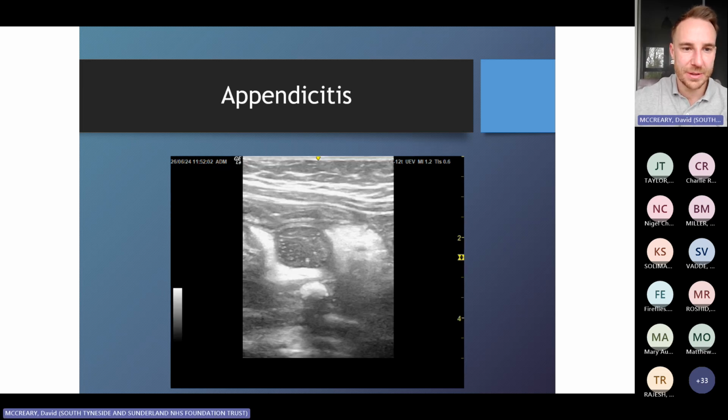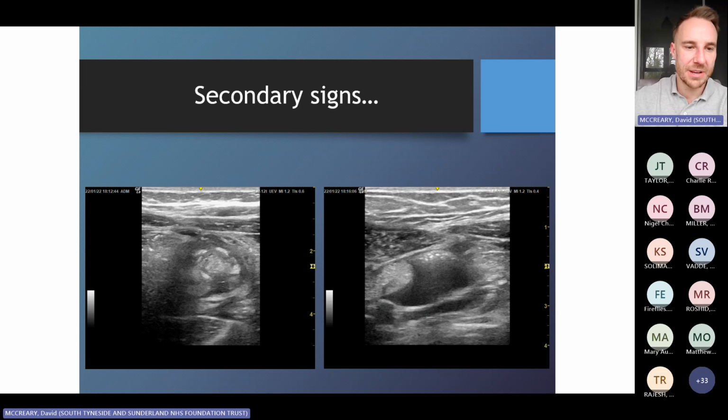Same thing here, blind ending loop, very echogenic around it, all quite unusual. Probably measures quite small, this one. I'd say it would be borderline in terms of measurement, 0.6, but all very bright, all very unusual. And you've got a tender patient, you're pressing there, you've answered the question. This is another example I've got whereby everything's wrapped around, probably a central structure there. That's a really great example of hyperinflammatory fat wrapping, all really abnormal. And again, more pockets of free fluid, really unusual shapes. Some of that fluid might be interloop, and maybe that's interloop there, probably is. But this bit looks much more like free fluid. It's got these sharp, spiky edges and corners that shouldn't be there for free fluid, just beneath the muscle.